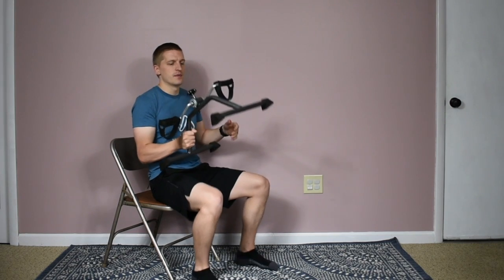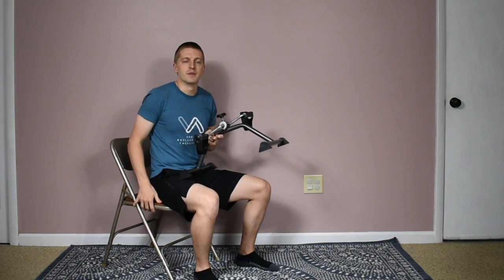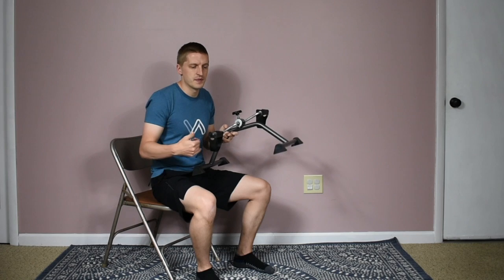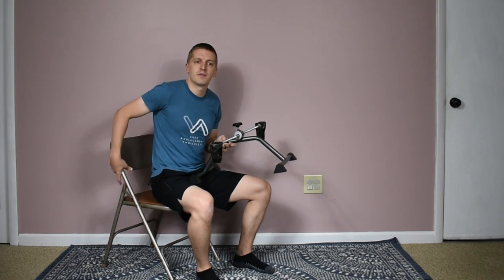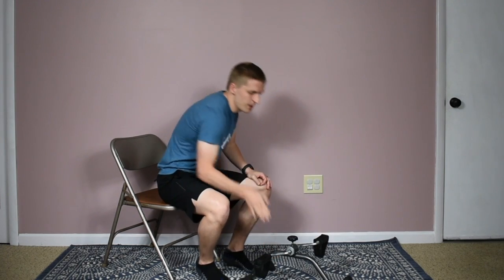Some tips for using this device: first, you want to be in a supportive chair. If you're having issues with your feet or the machine moving around on a slippery surface, back your chair up against the wall or a larger piece of furniture like a couch or table so the chair won't slide when you're pedaling. You can also put the front part of the peddler snug against the wall so the machine won't move on you either.